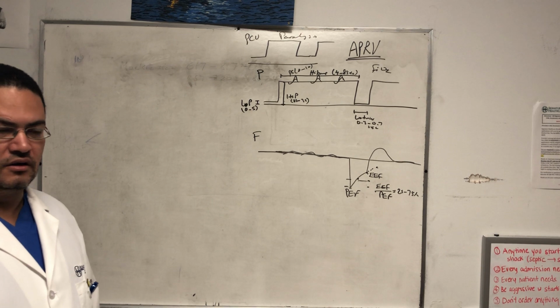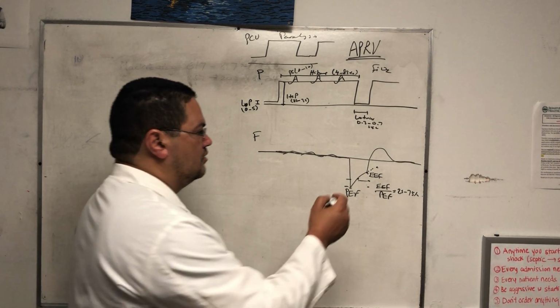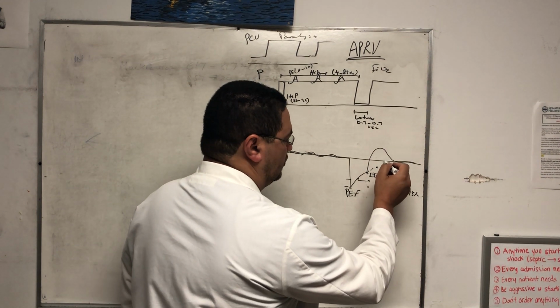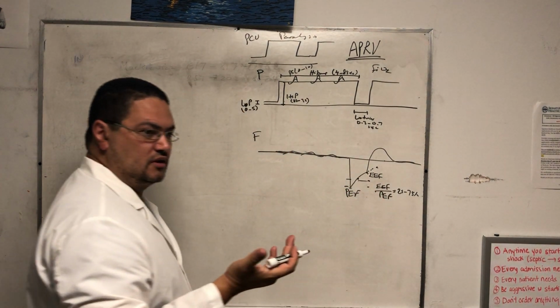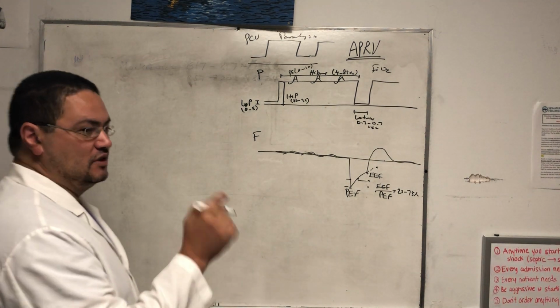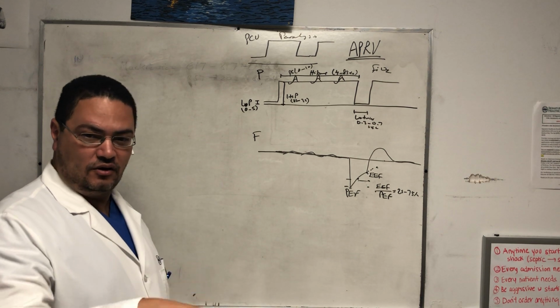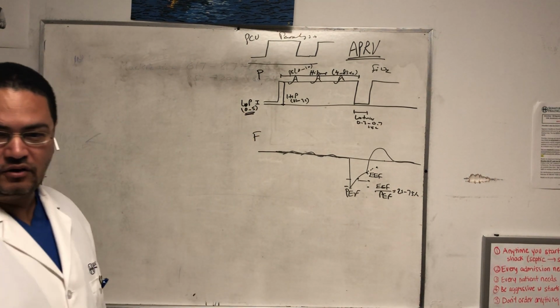Some of the alveoli are gonna completely close because of what? If you reach all the way to zero on the flow, that means your lung doesn't want any more flow. That means you actually exhaled fully. That means the lung is now seeing the low pressure, which is what? Very low, 0 to 5.